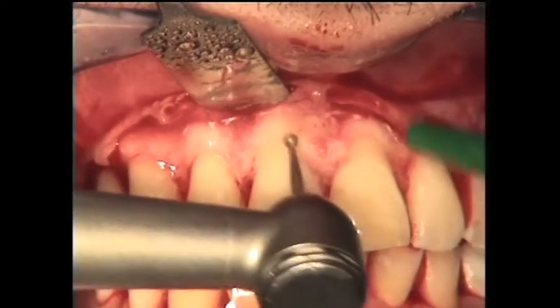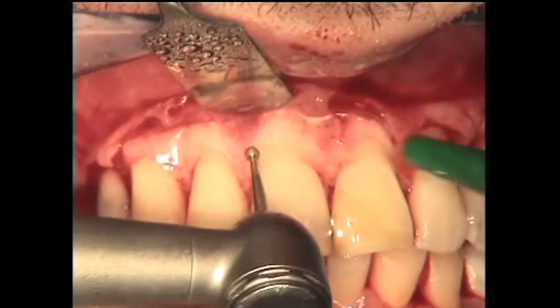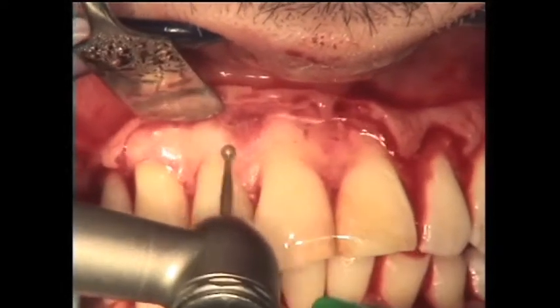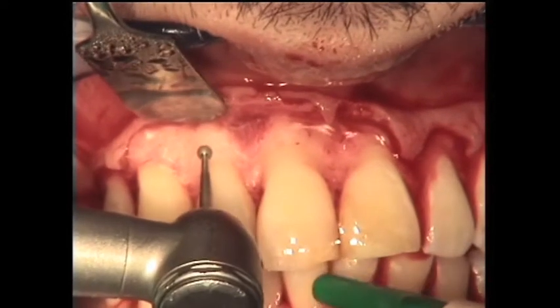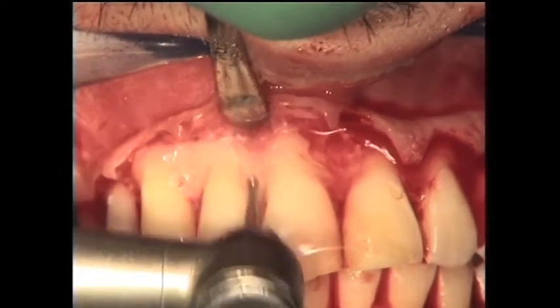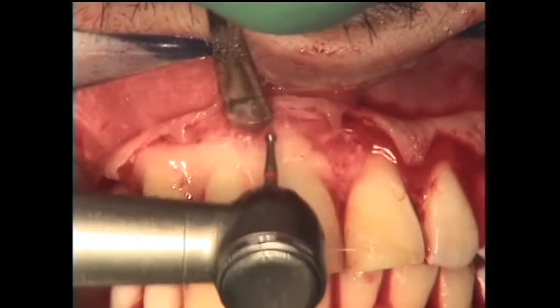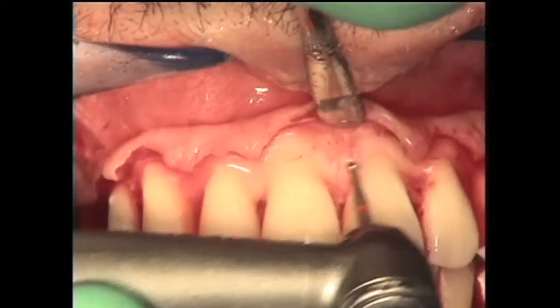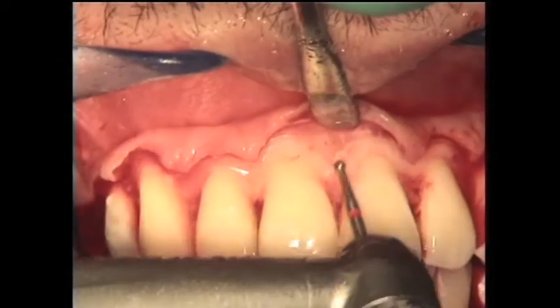and by keeping a positive anatomy, so the interproximal bone more coronal compared to the buccal bone, we create grooves in such a way that the gingiva can reposition itself in the interproximal spaces once the surgery is completed.